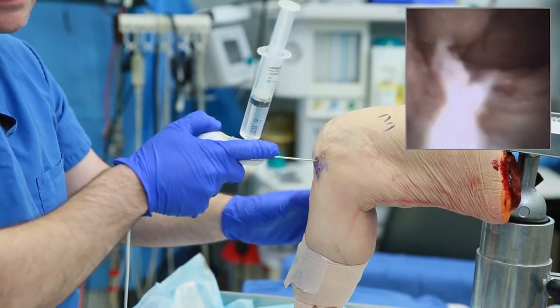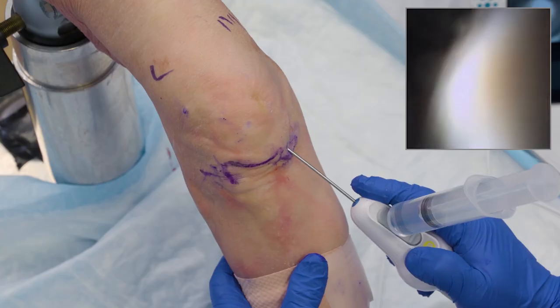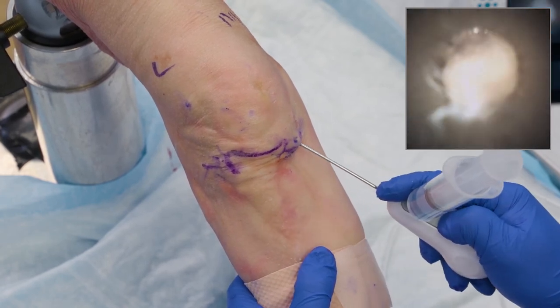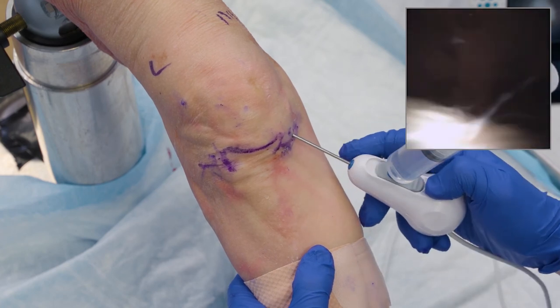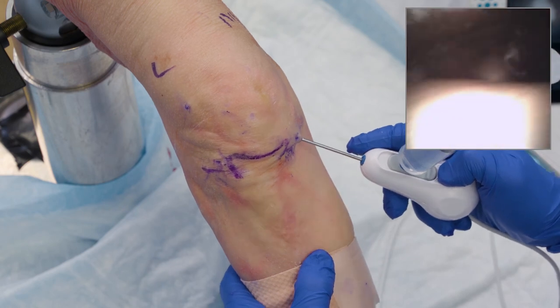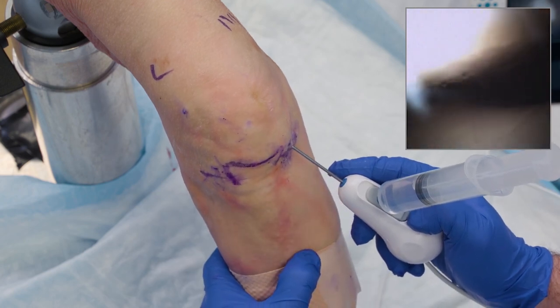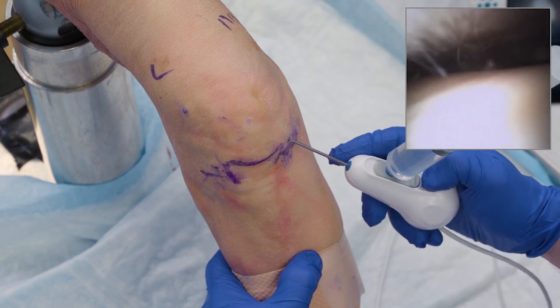From here I can withdraw back, extend the leg, and go suprapatellar one more time — looking at the condyle cartilage and pushing up with the leg in extension into the patellofemoral joint. There's my patella right above me and my trochlea there. I can see the leg extend and flex, and observe the good articulation of my patella on my trochlea and how it's tracking. That's just one more way to get into the joint if the fat pad is holding you up.